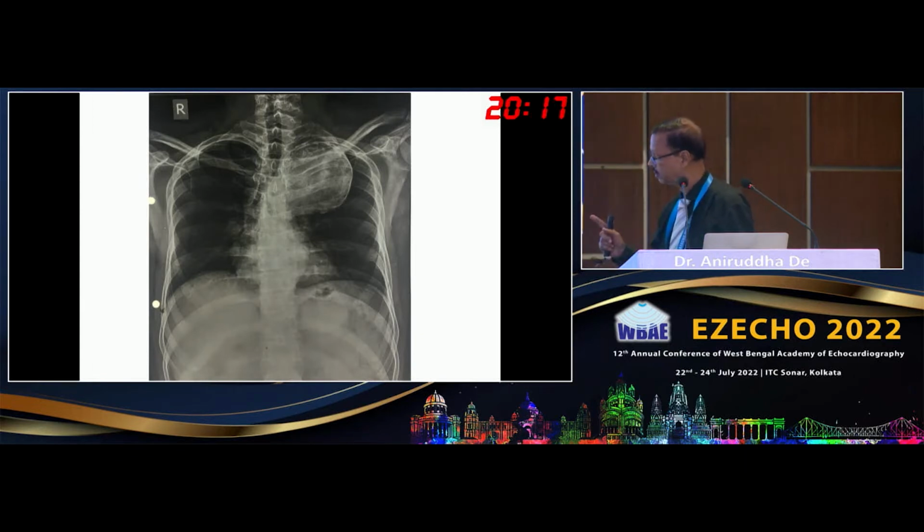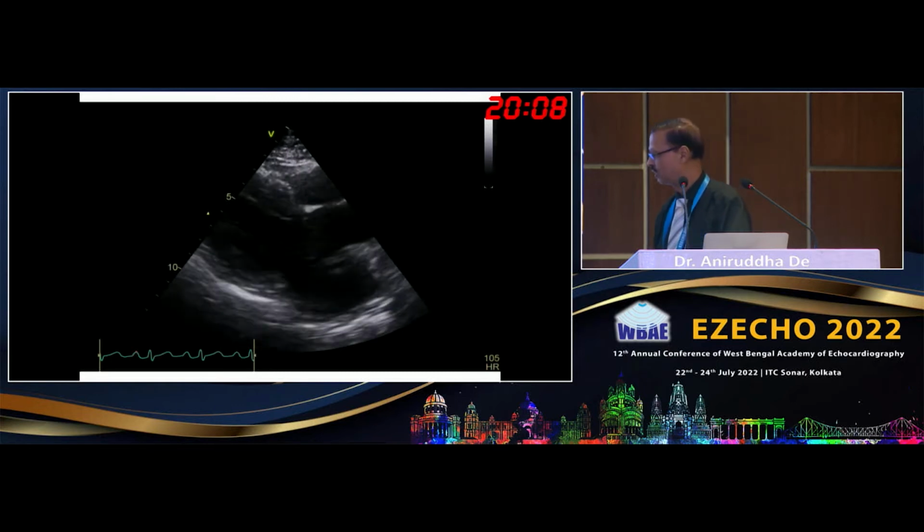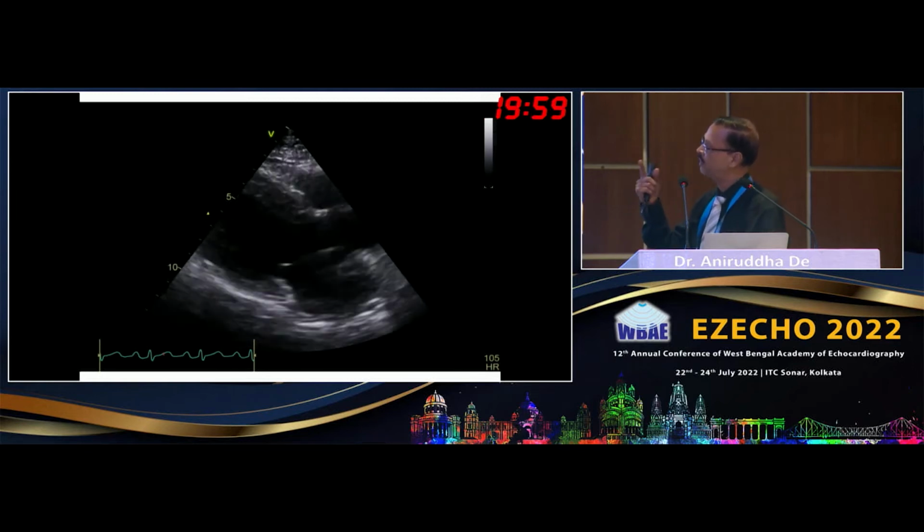Actually, ask for it. What you are doing is very important, because as I go to the case, that is very relevant. See, this kind of thing we have seen in people with a past history of trauma. They have pseudoaneurysm at this point, typically involving the post-subclavian, isthmic junction. Absolutely correct, sir. So now I'm going to the very interesting fact about that.